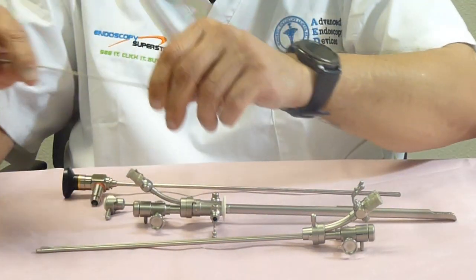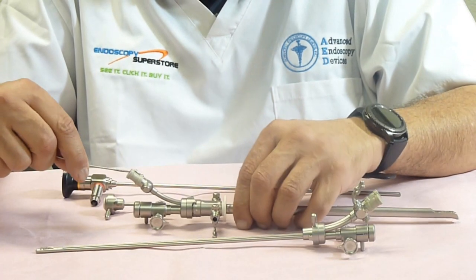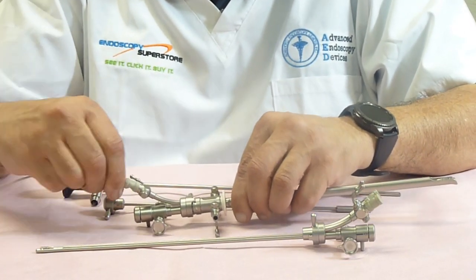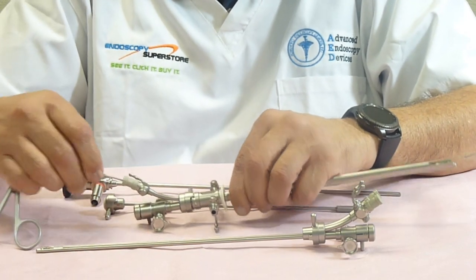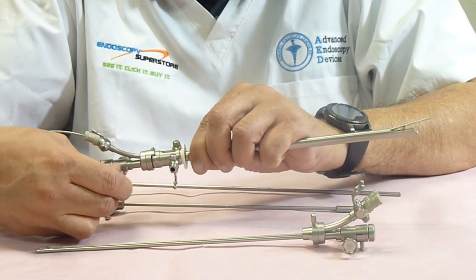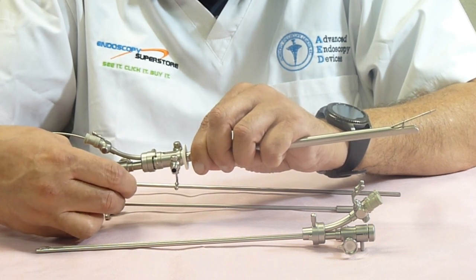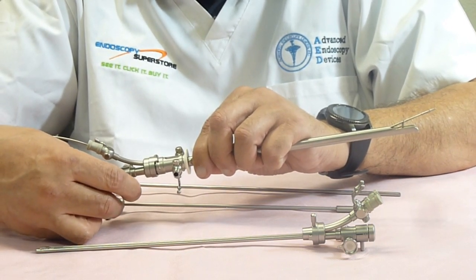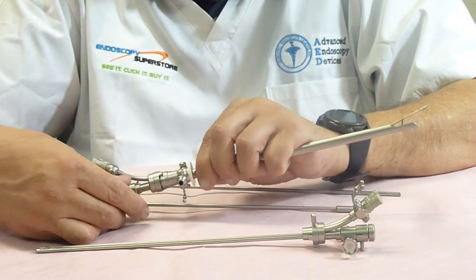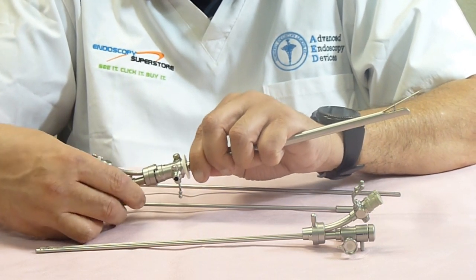The advantage of having a deflecting bridge is that when you want to take a biopsy or grab something on the floor or the roof of the bladder, you can just deflect it and be able to do what you need to do. You can grasp something, put a laser fiber in there, put an injection needle, put a Bugbee, and direct it to whatever angle you want.